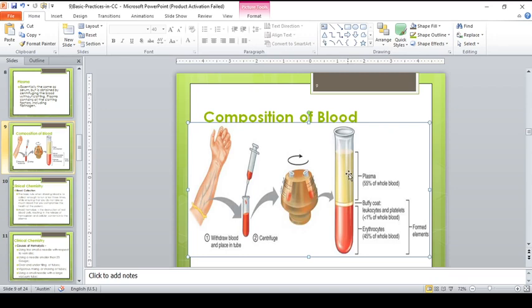On the other hand, for serum, once the formed elements are clotted, hindi mo na siya pwedeng ma-mix. Kasi nag-form na together yung platelets, WBC, and the red blood cell. And aside from that, there is no clear separation of buffy coat and the red blood cell.